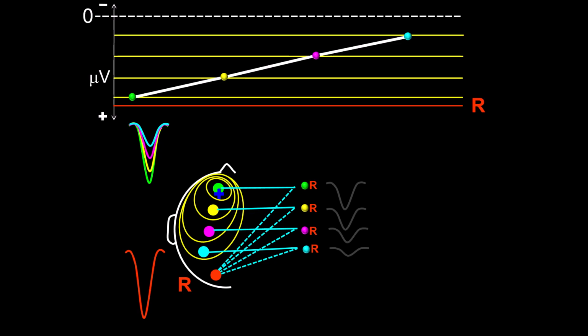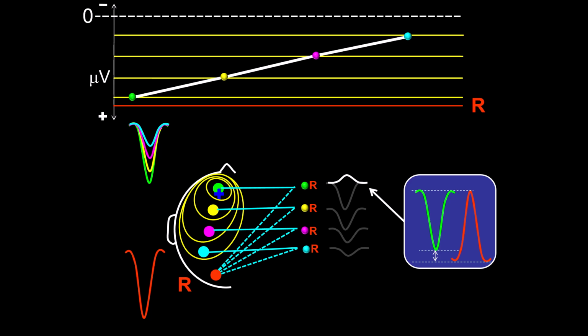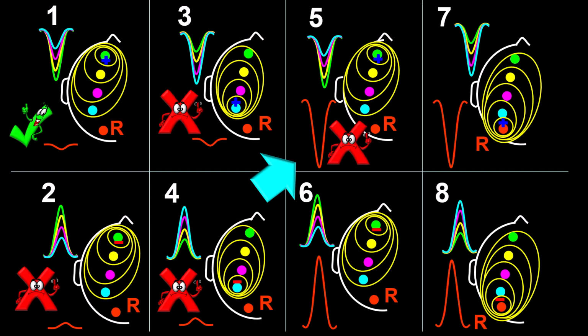The gray waves, as in the previous frames, indicate the waves in question. I have introduced the blue box and the corresponding wave after the activity that takes place in the differential amplifier. You can see the wave doesn't correspond with the one in question arising from the first derivation. So 5 is not a sound option.